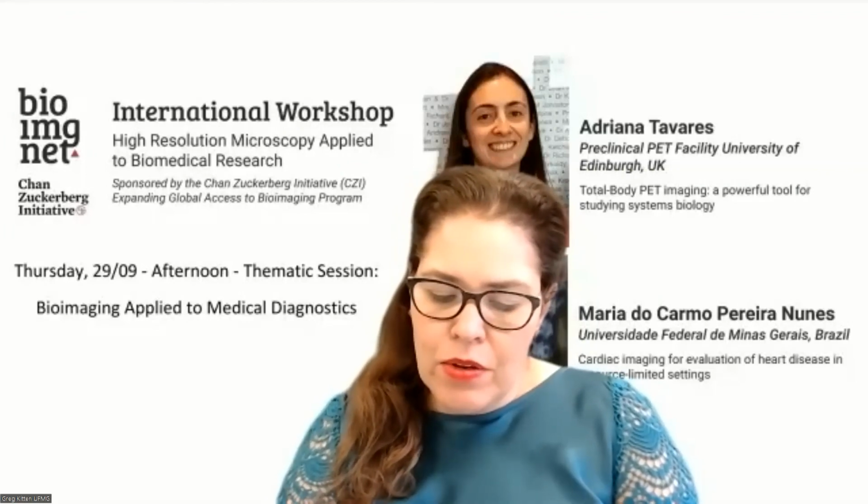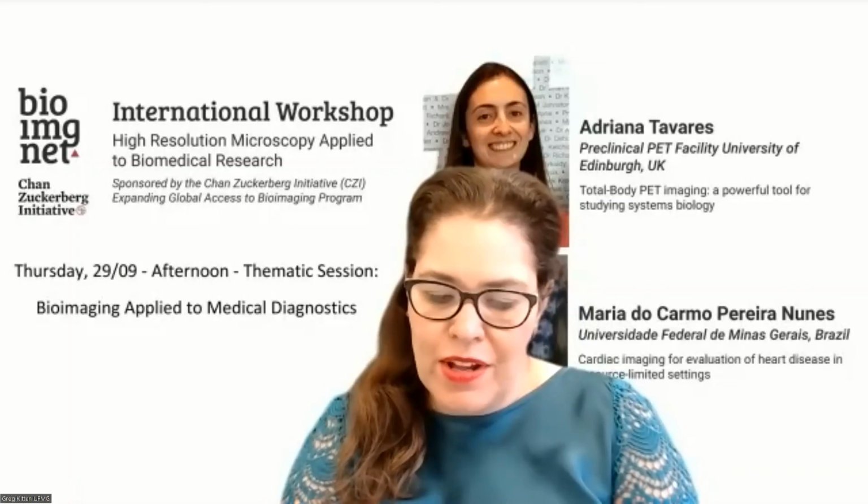Nice. And one curiosity, is the price of the radio tracers still an issue? Yeah, that's a very good question. It is still an expensive technique, but what we know is that with these total body PET scanners, we can reduce that, because one of the things I did not discuss too much is that with these new scanners, we can inject potentially up to 40 times less and get good image quality. That means one batch of radio tracer that we use for one subject now could be used for 40. So that would reduce the cost of the technique long term, which I think would be very helpful to allow as many people as possible to use this technique.